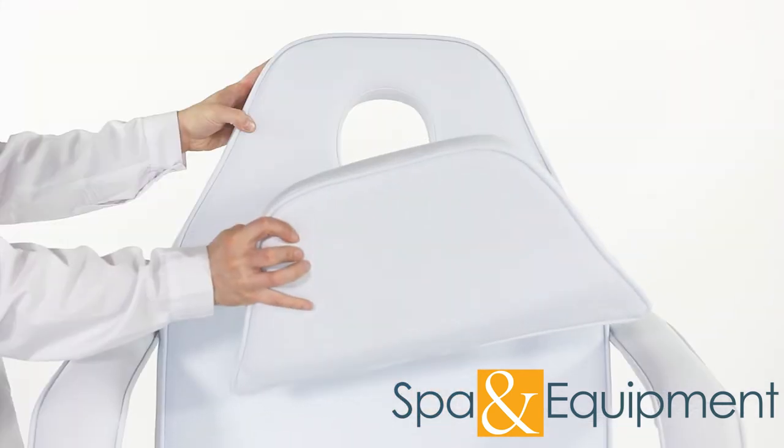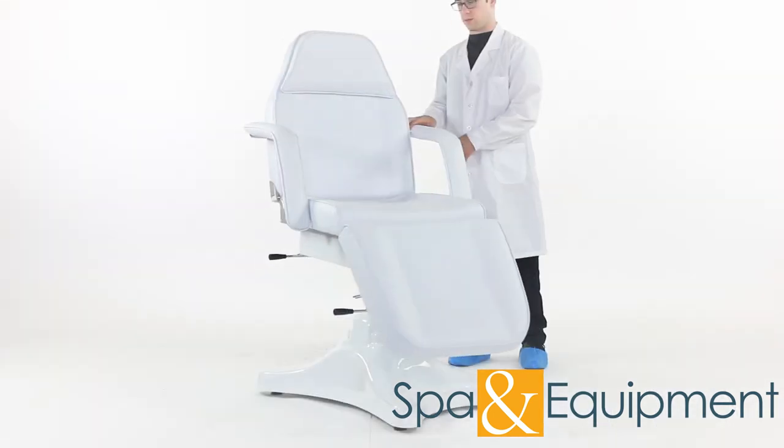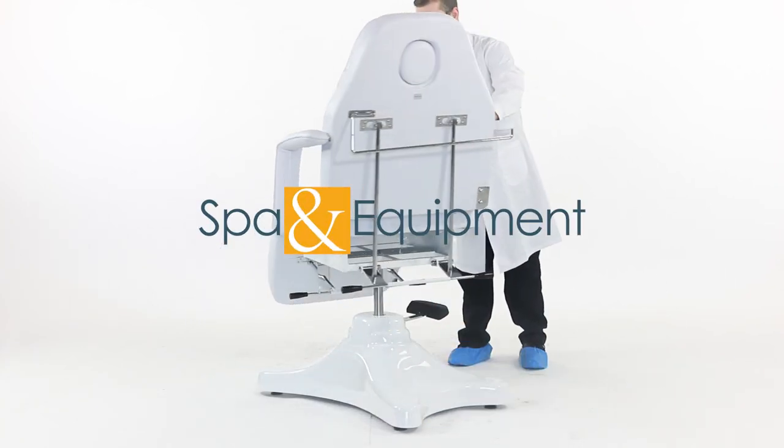Finally, you can put the pillow into its place. There you have it — your chair is fully assembled.